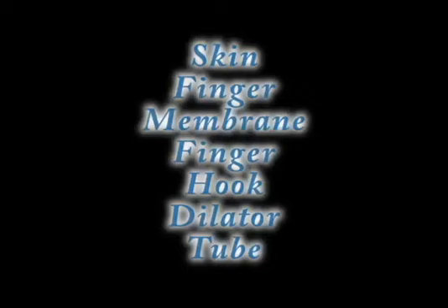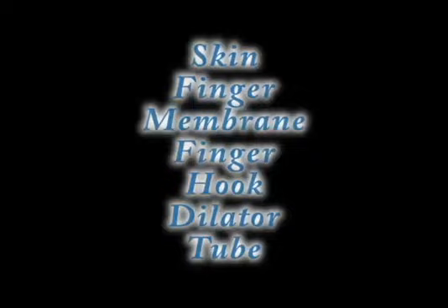Here's the deal again. The idea is: skin, finger, membrane, finger, hook, dilator, tube. Skin, finger, membrane, finger, hook, dilator, tube.